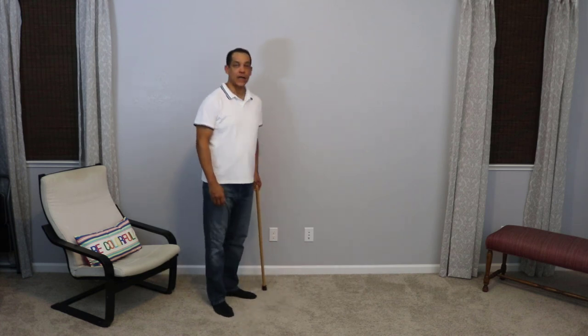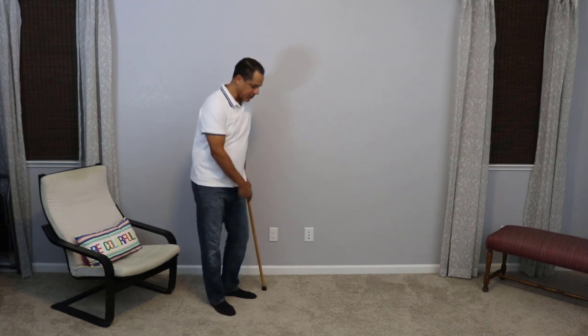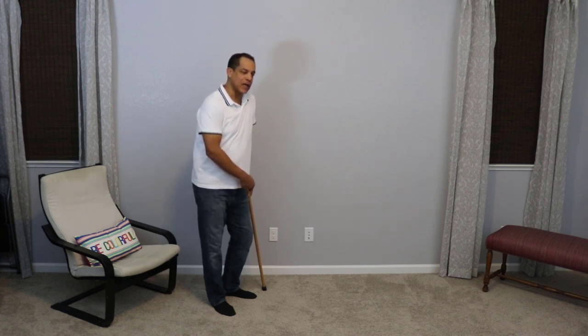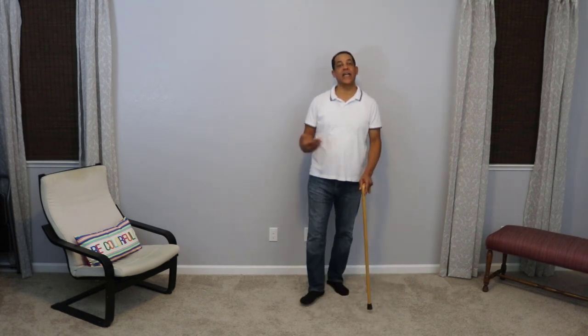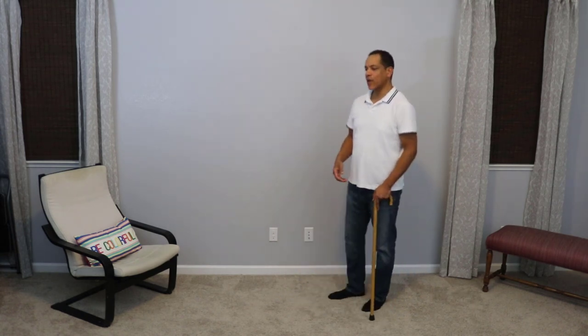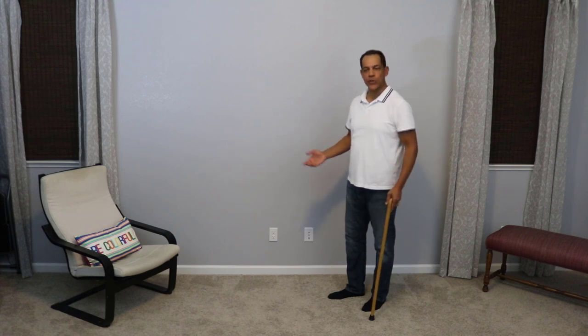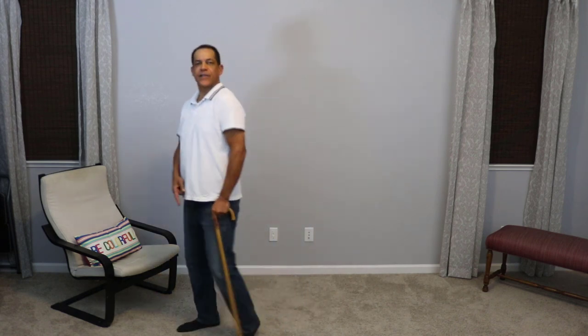Now some people, like Dr. House or others, will use the cane on the bad side. If I'm using the cane on my bad side, what it's going to do is force me to walk unnaturally. I'm going to use an unnatural gait cycle or cadence, and it's not going to give me the most support. It might cause other problems in my body because it's just not a normal motion.